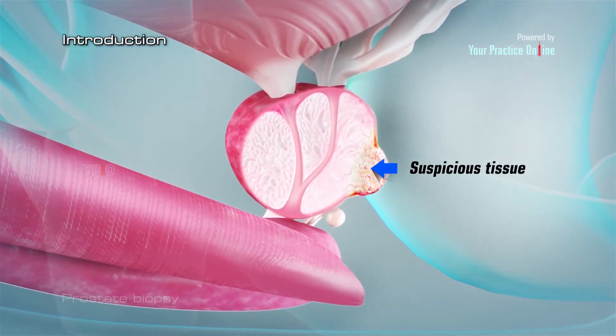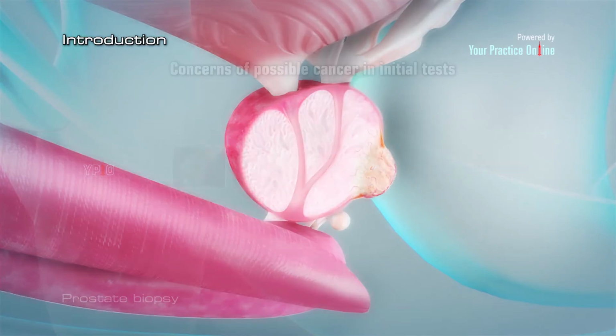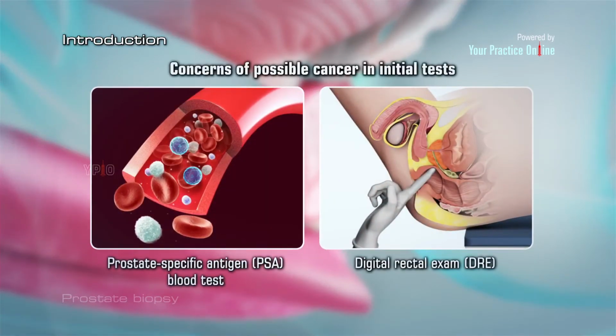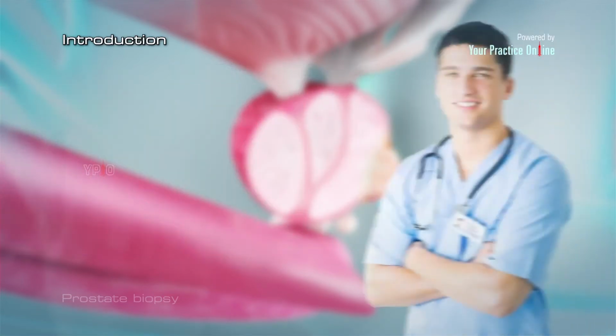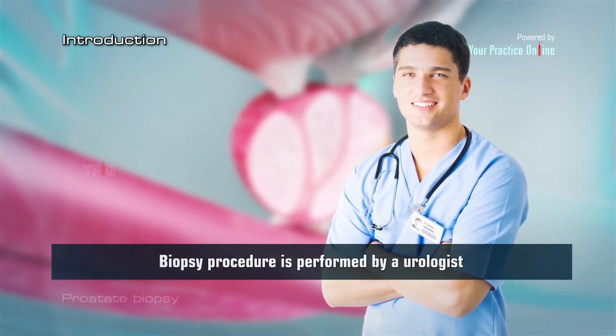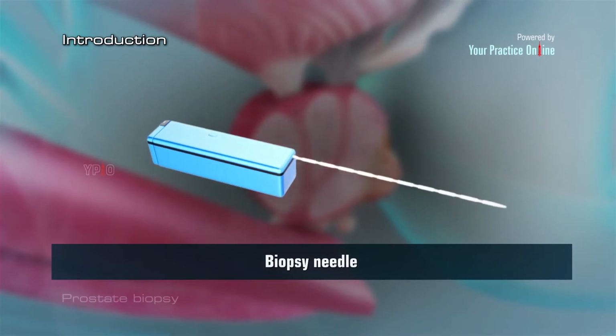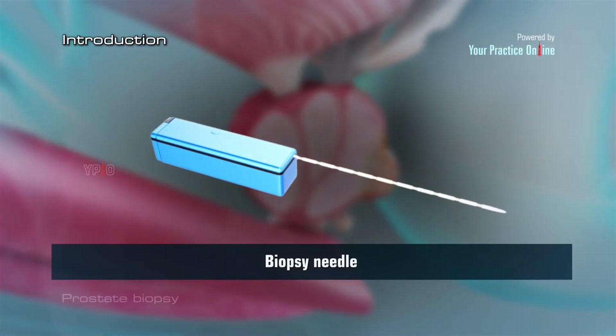Prostate biopsy is recommended when the results of initial tests, such as prostate-specific antigen (PSA) blood test, or digital rectal exam (DRE), raise concerns of possible cancer. The biopsy procedure is performed by a urologist. During the procedure, a fine needle is used to collect tissue samples from the prostate gland.